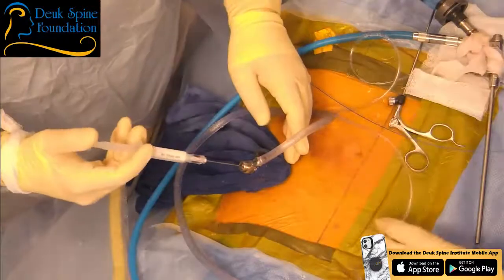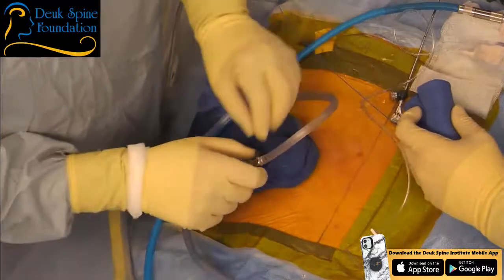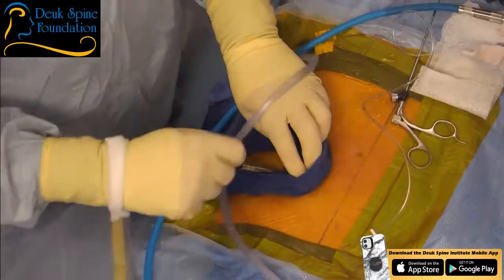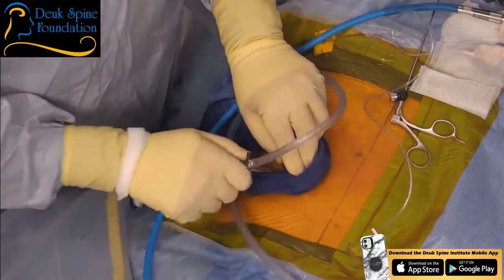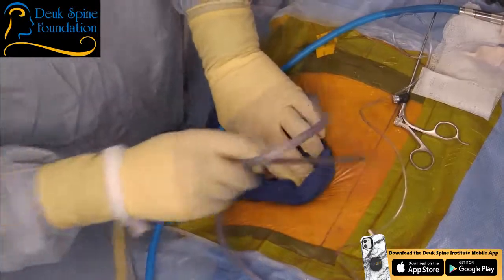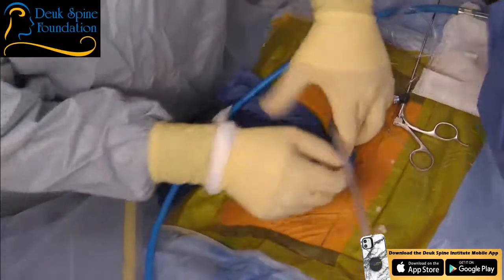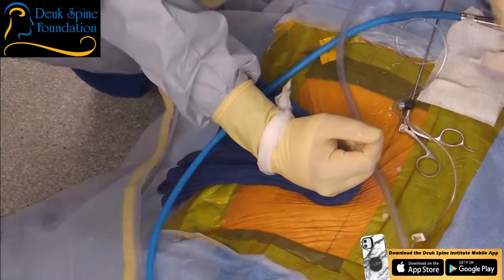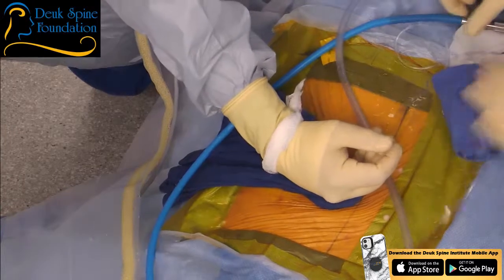Put a little medicine to give him some relief. You could see the nerve root was not red and inflamed. It was white because it's not a radiculitis. We're not dealing with a leg problem here, like leg pain. We're dealing with back pain. This patient had the surgery for back pain, and his nerve root was fine. We're not dealing with a leg pain issue, sciatica. We're dealing with back pain. So we're the only center in the world that actually treats back pain and cures back pain because we're the only place that does this surgery.